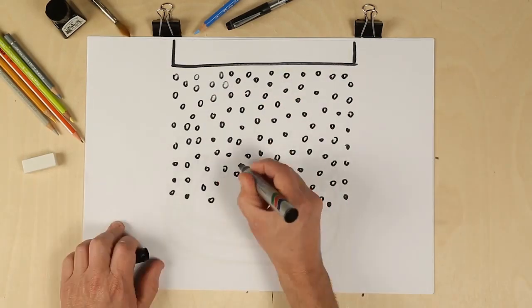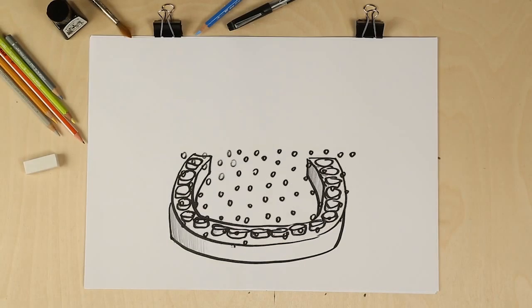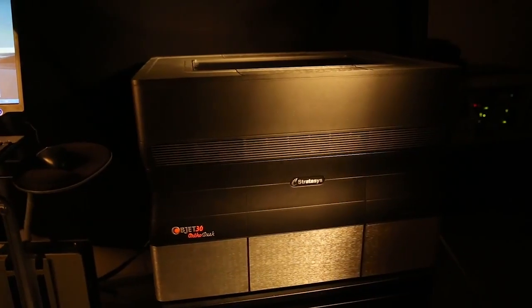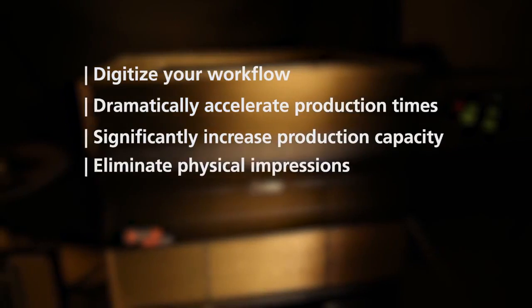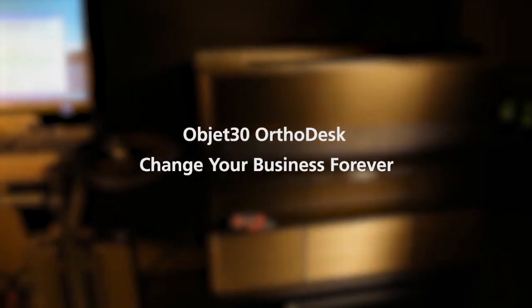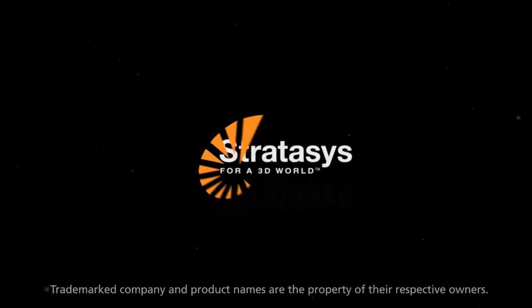It uses Objet inkjet 3D printing technology to print ultra-fine layers of material for smooth, accurate models. You can create as many as 20 models per print run. Just like larger, more expensive systems, the Objet30 Ortho Desk gives you the power of cutting-edge technology at a price you can afford.